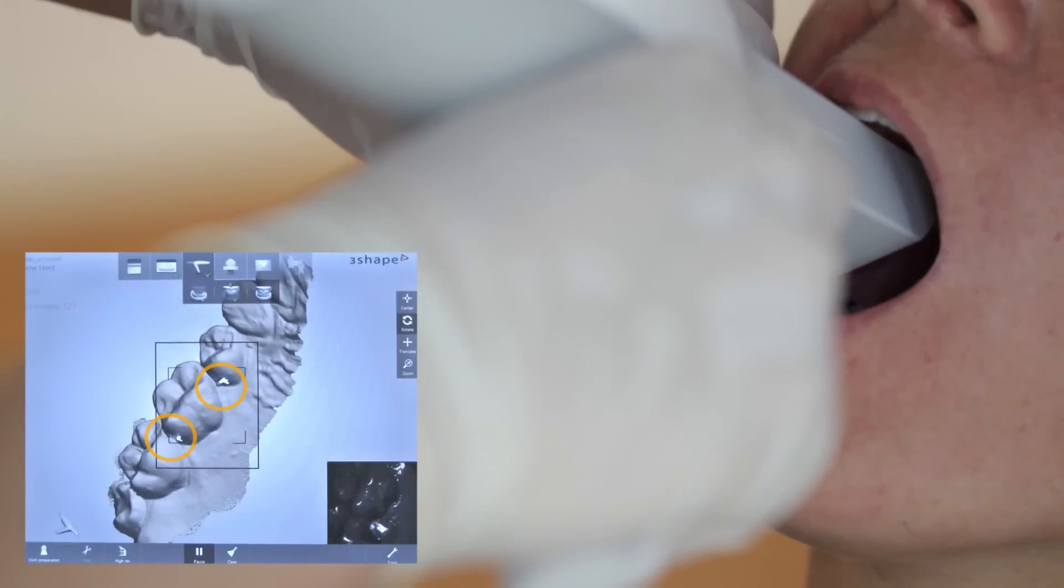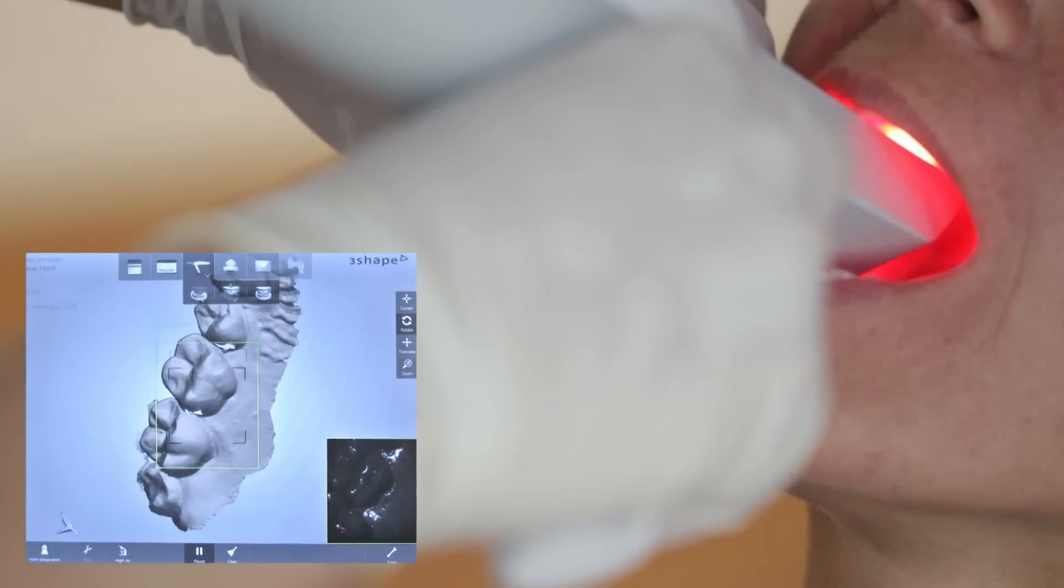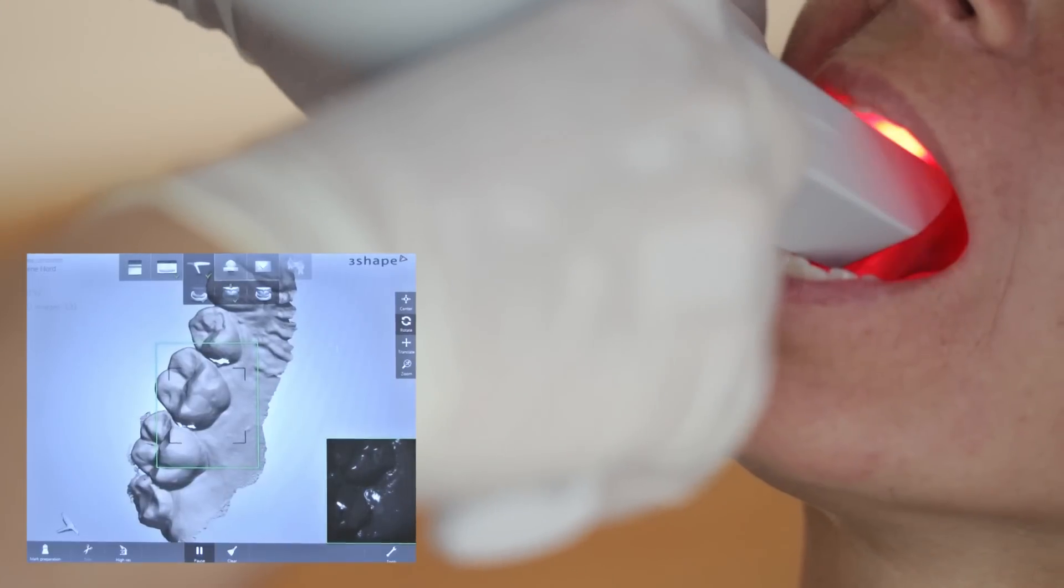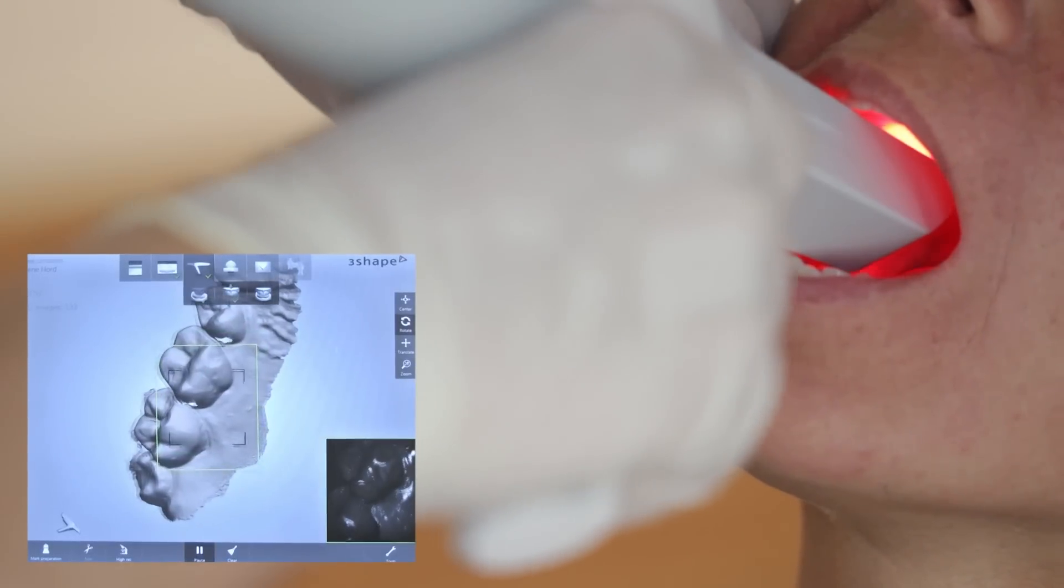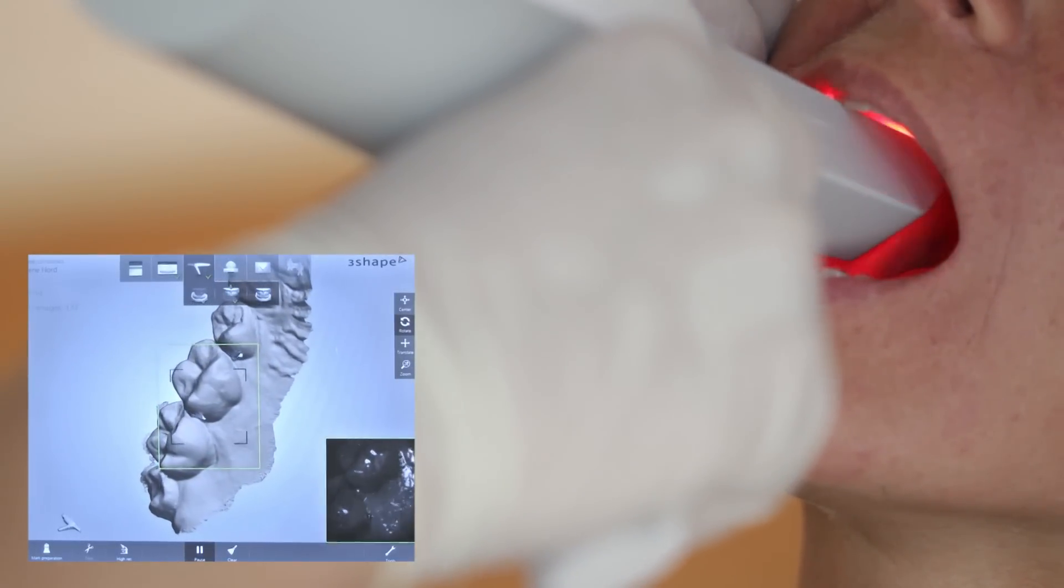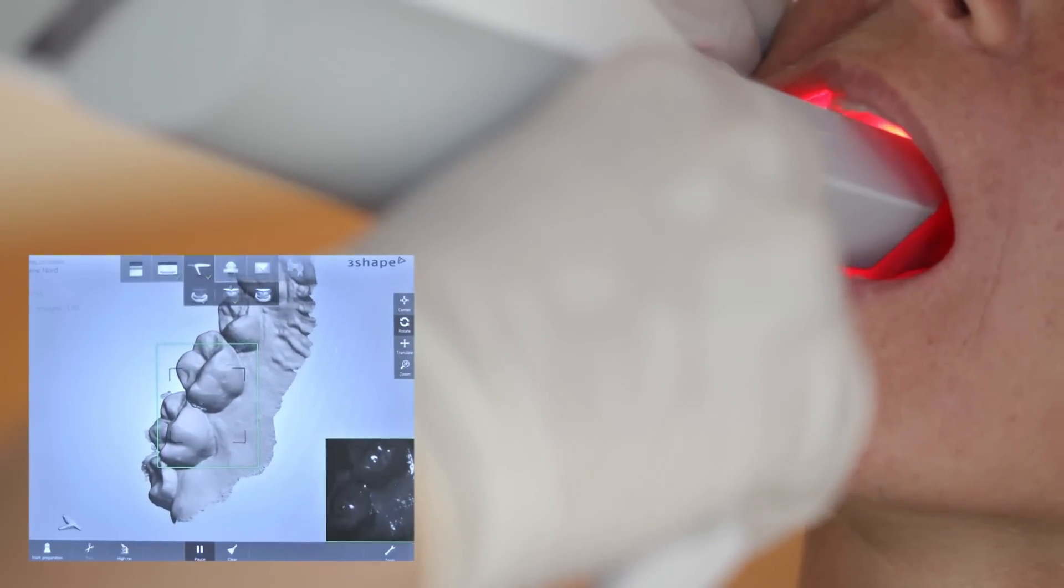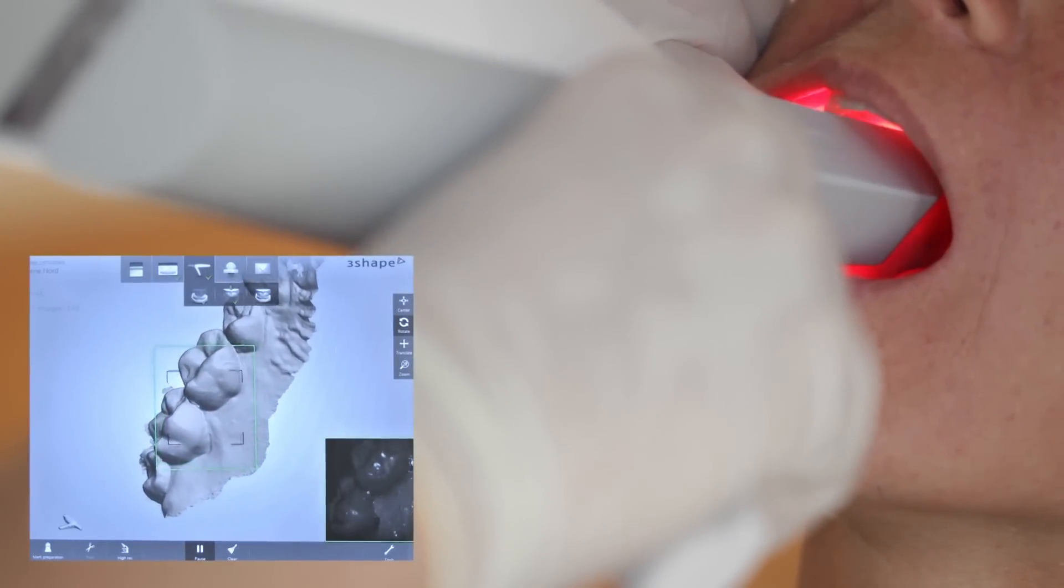If you missed areas, you can fill the holes by simply adding more scans. The 3D model will be updated accordingly.